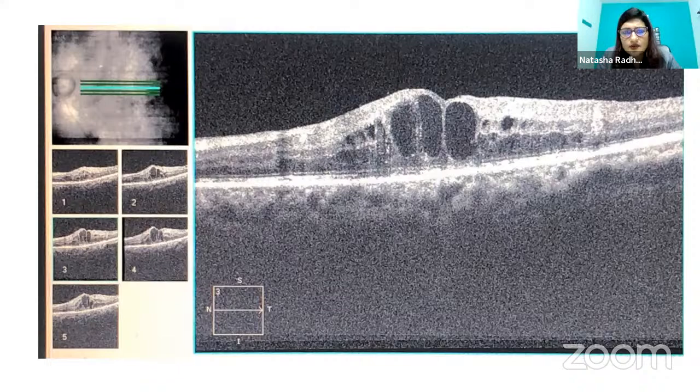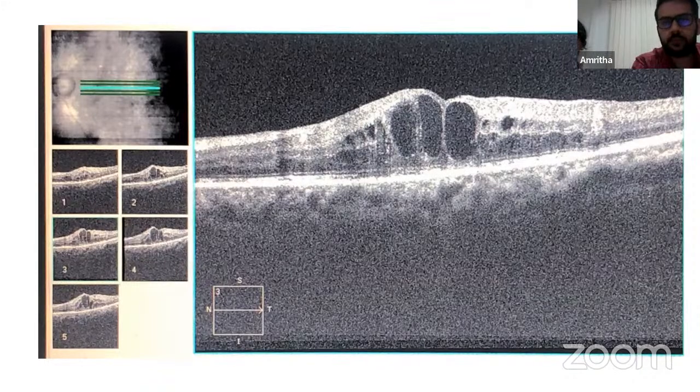Can you tell us some causes which are likely cystoid macular edema? In case he is a pseudophakic, so a history of recent cataract surgery, especially in a background of diabetic retinopathy, let's say mild to moderate NPDR, and undergoing cataract surgery, chances of pseudophakic CME are increased.